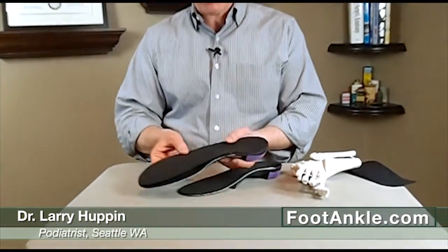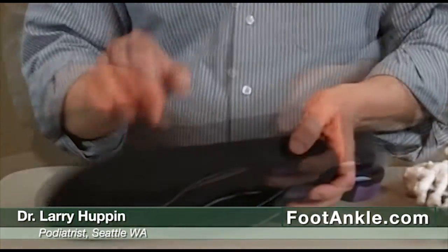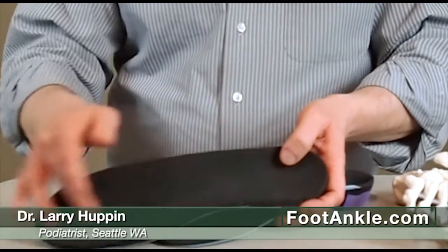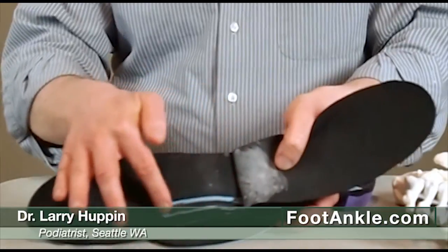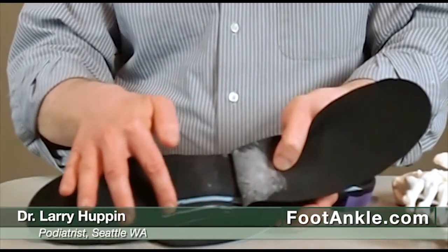Some patients have a very prominent plantar fascia — that's the thick ligament on the bottom of the foot — and that ligament can be irritated by the arch. So for those patients, we might put a groove into the orthotic to take pressure off of that area.